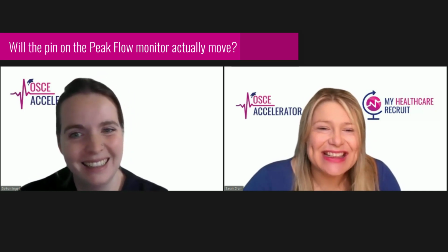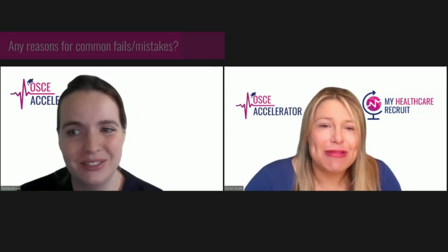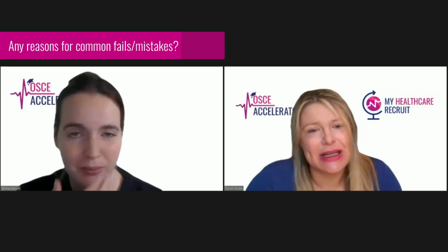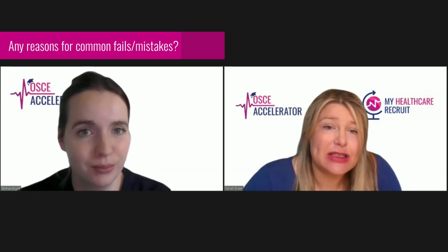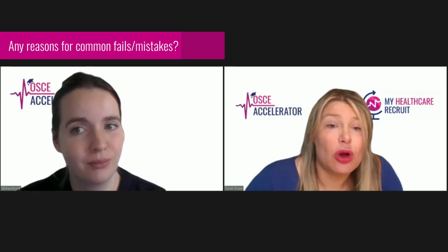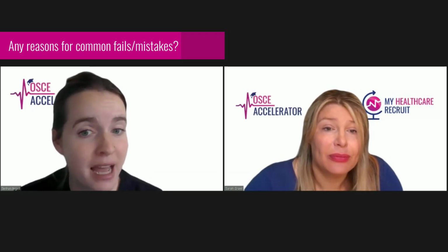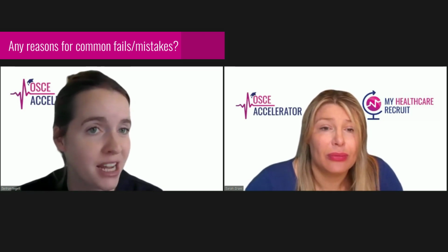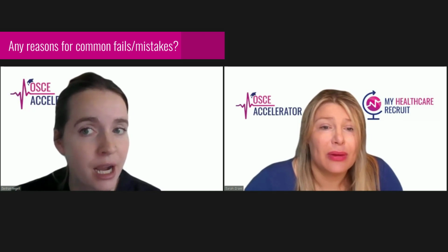Yeah. And in terms of any reasons that a candidate might get a mistake on the station, get a fail on this station, I know it's probably one of the more straightforward stations, but what have you seen that's perhaps not gone quite right at this station? So forgetting to reset that needle in between readings, you're not going to get that accurate reading if you don't reset it.